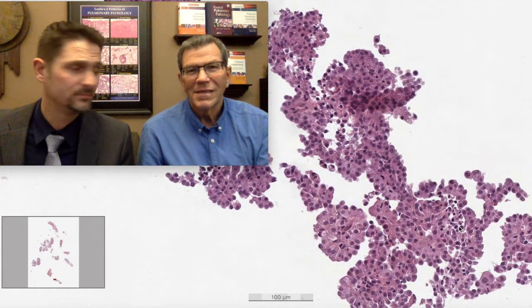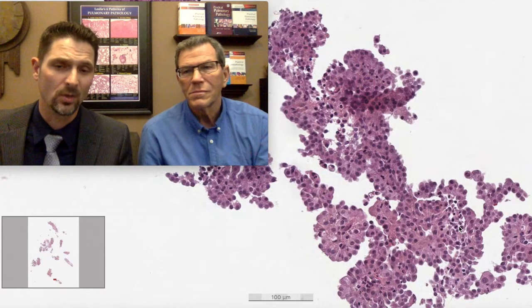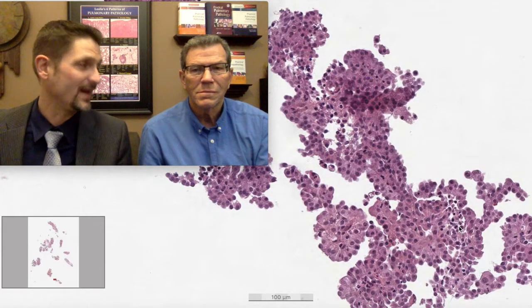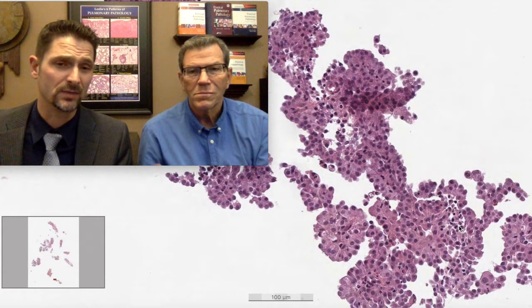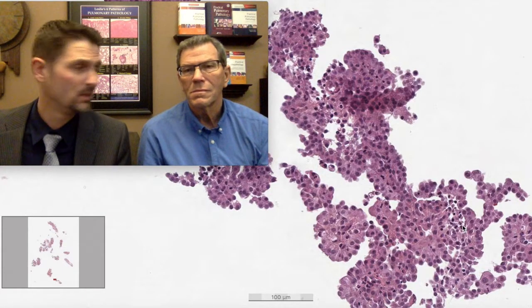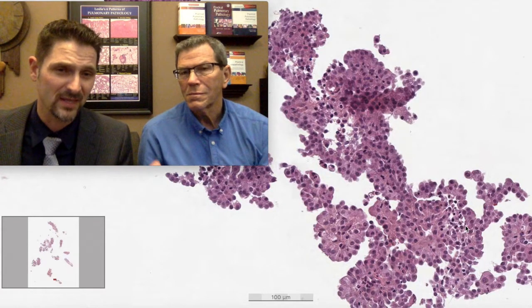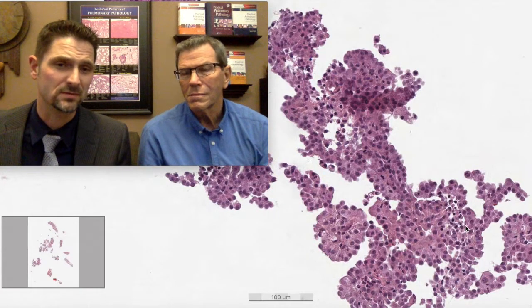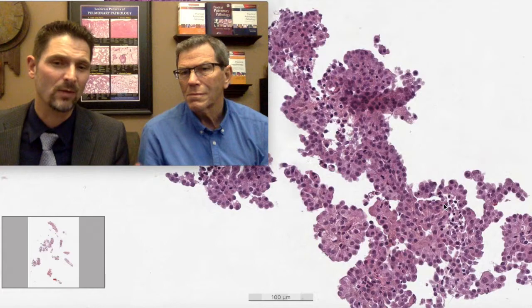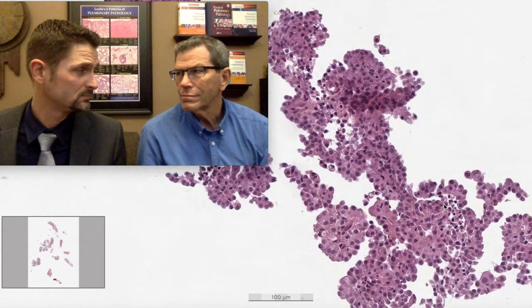Now, on the adeno side, negative for TTF1, negative for polyclonal CEA, negative for MOC31, and negative for BerEP4. Great. So we've got everything on this case. We have a clinical history of an older male. Mesothelioma happens in older patients and typically in male patients. We have classic radiographic features: multiple pleural-based nodularity with recurrent pleural effusions. We have classic histology of epithelioid mesothelioma, and we have a perfect immunohistochemical staining pattern. We're done.